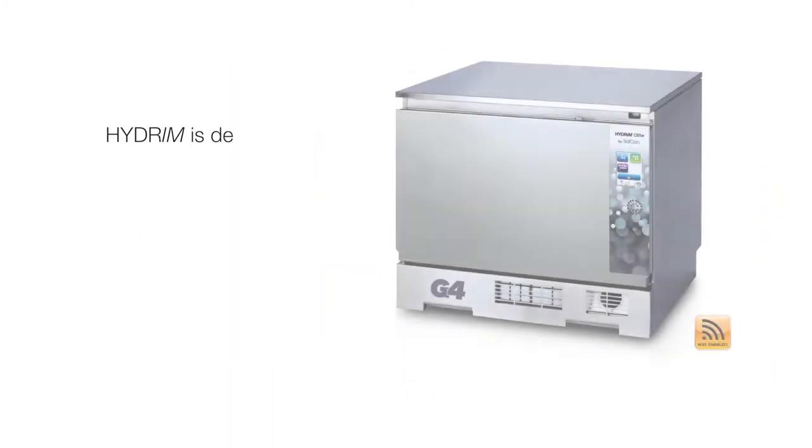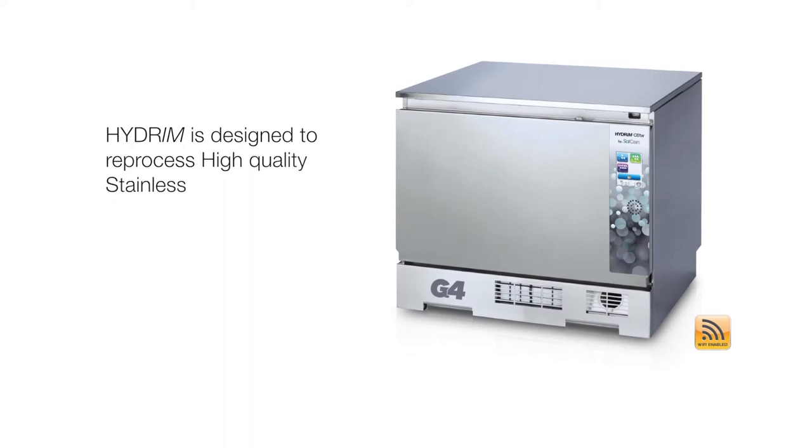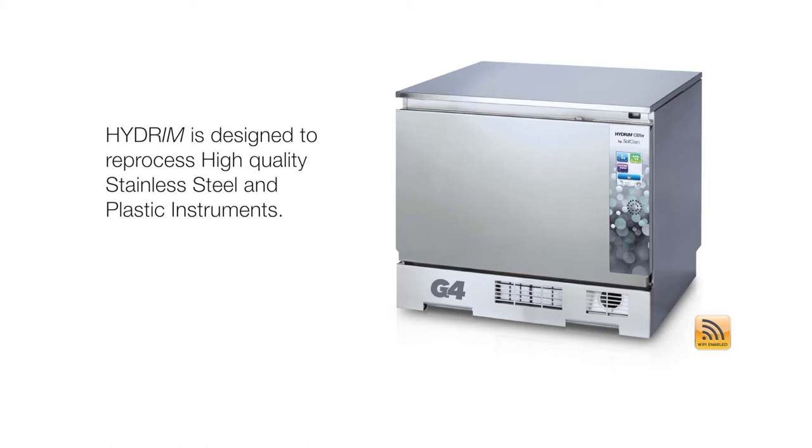Hydrim is designed to reprocess high quality stainless steel and plastic instruments. Not all instruments and cassettes are compatible with Hydrim. Do not reprocess dissimilar metals such as ultrasonic inserts, carbide burrs, and aluminum, anodized or chrome-plated instruments.